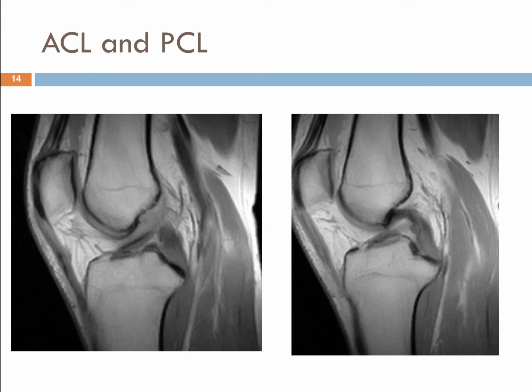This is an image of an anterior cruciate and a posterior cruciate. If you look at the image on the left-hand side, the anterior cruciate is that black line. It's a very thin, spindly thing that's supposed to connect all the way up to the femur, but it doesn't in this particular case. The posterior cruciate on the right-hand side is a thicker bundle of fibres. Often you'll hear people talk about snapping and popping, and they can actually hear these go on the field.